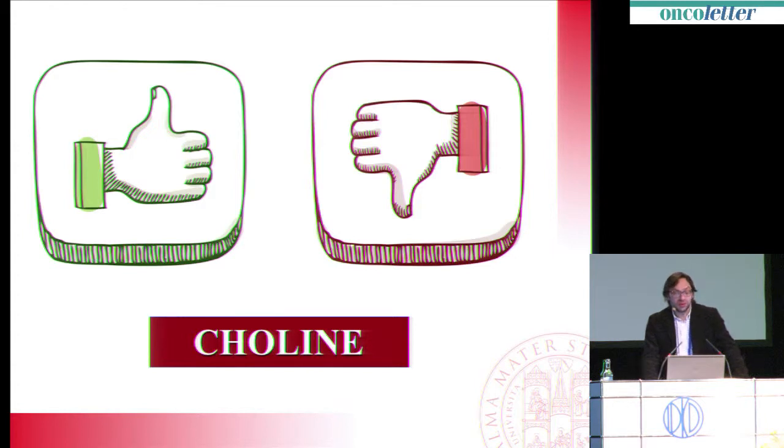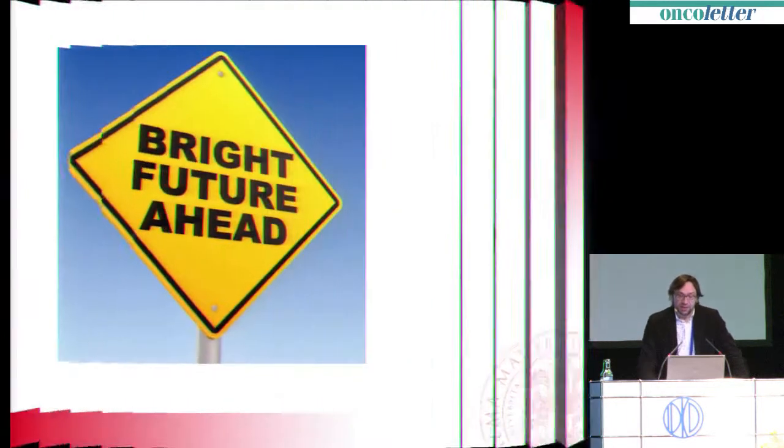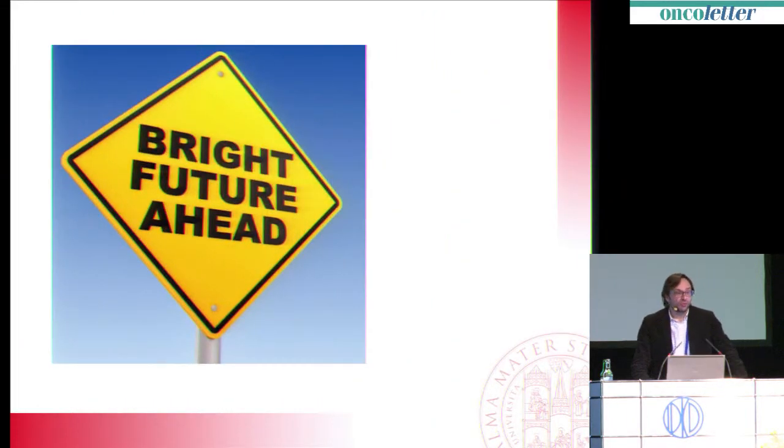Nonetheless, there are pros and cons about the use of choline. Again, it could be available, but the diagnostic accuracy is sometimes suboptimal, especially when you deal with low PSA values and your sensitivity is in the range of 50%. You have to consider that you're much better than the conventional imaging, which, especially for nodes and for bone evaluation at that early recurrence, is extremely low, but nonetheless it is not as high as it would be. So the bright future is just around the corner, hopefully, because a couple of new tracers are coming very, very soon. And I guess that we could be very happy in the near future.